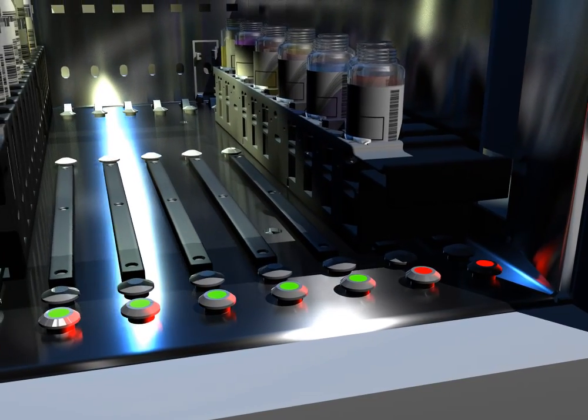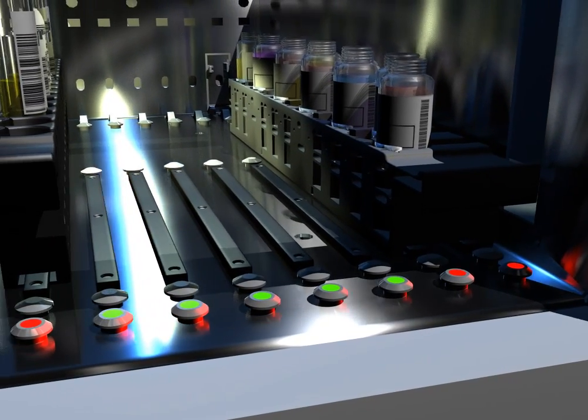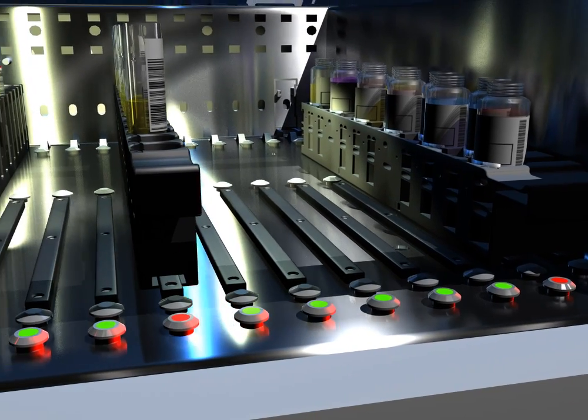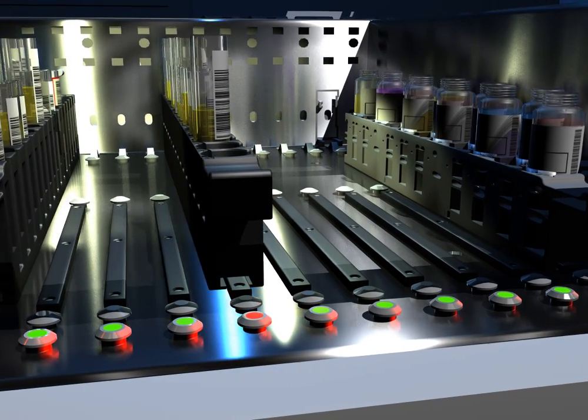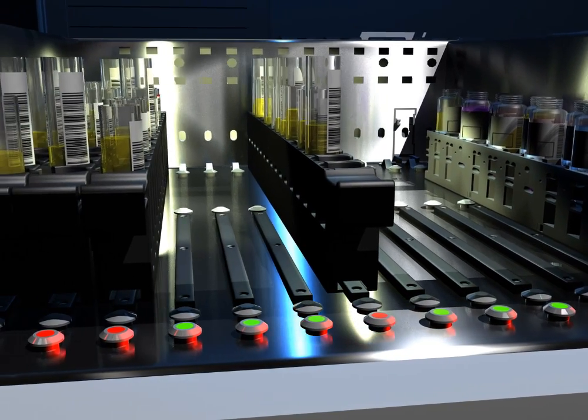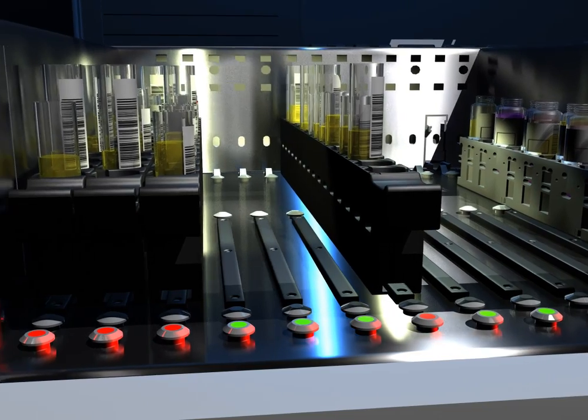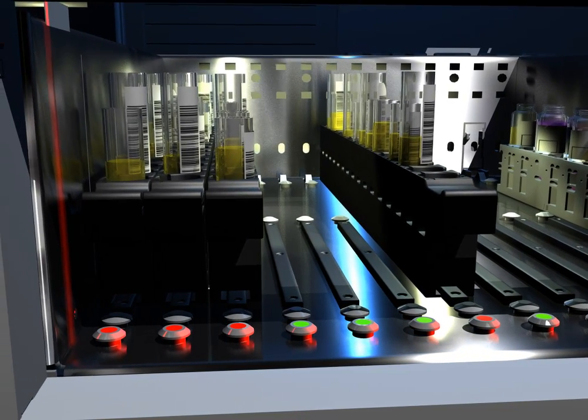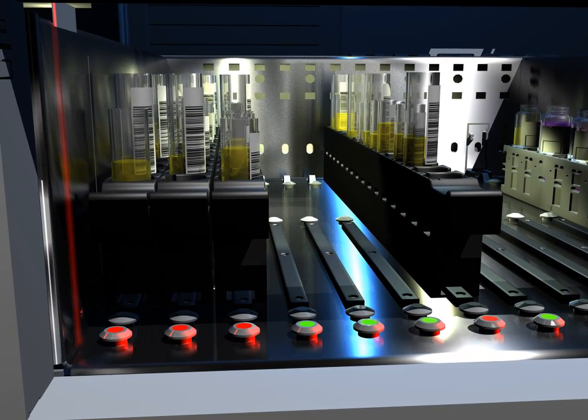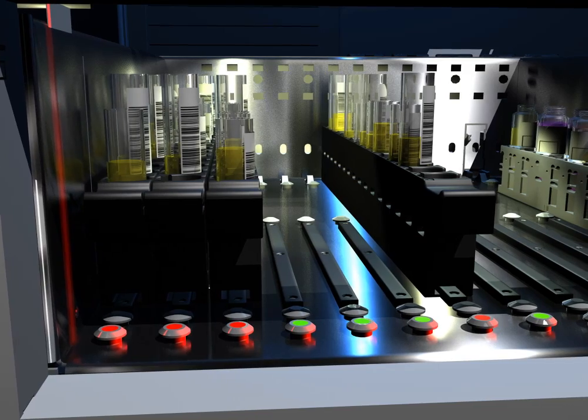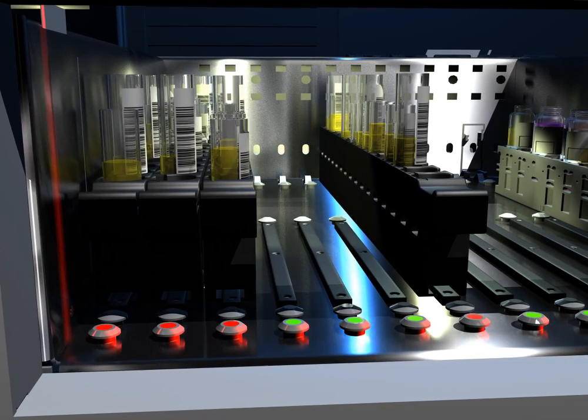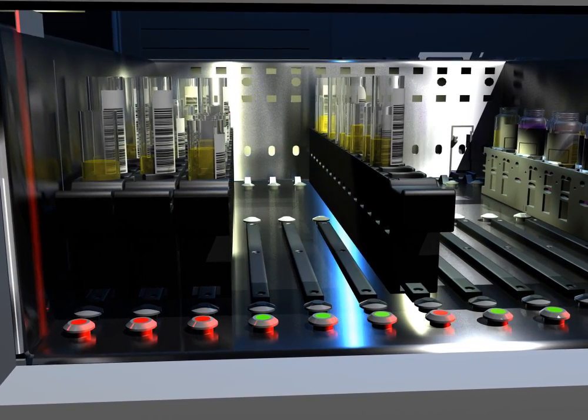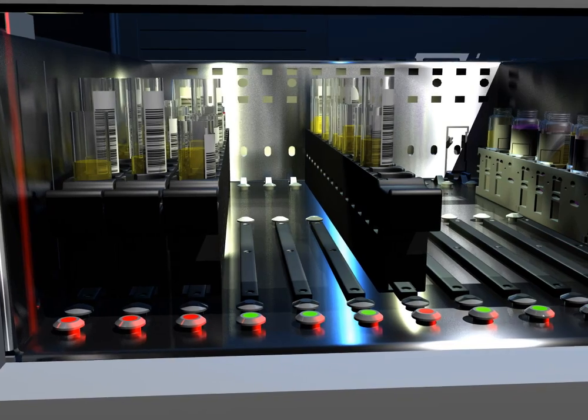LEDs allow the operator to determine which lanes are available for adding or removing a linear rack. A green light means that the lane position is available for use. An orange light means that a rack has been loaded, but no tests have been requested for those samples yet, so you can either leave it onboard and request testing or remove it.